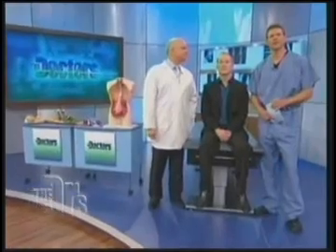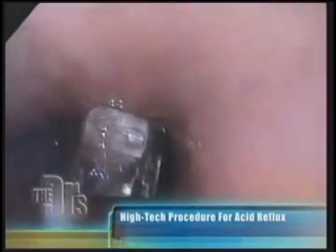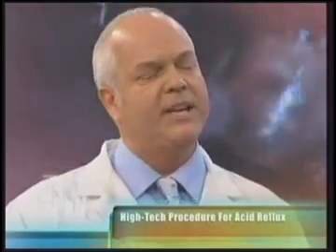Jacob is here with his gastroenterologist, Dr. Jorge Rodriguez. Welcome to you both. Thank you. Thanks for sharing your esophagus with all of us. Well, this is really fun technology because this Bravo chip gives you a look in real time what's going on with the acidity basically in your lower esophagus. Yeah, it's amazing technology. We like to call it the Hubble of inner space, you know, in GI, because you can sort of see for 2 days what's going on in there, what his pH is.